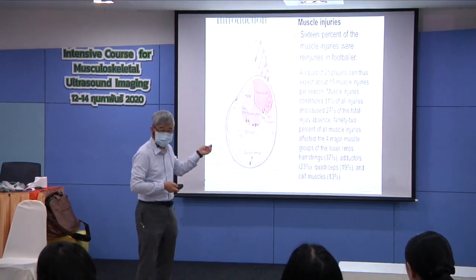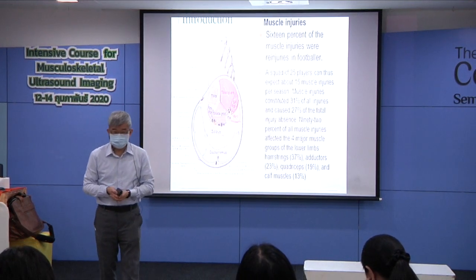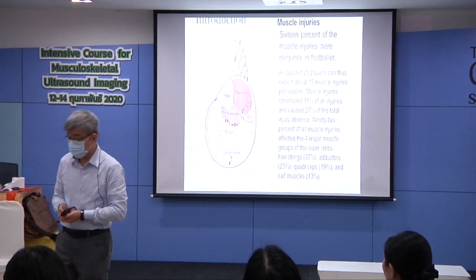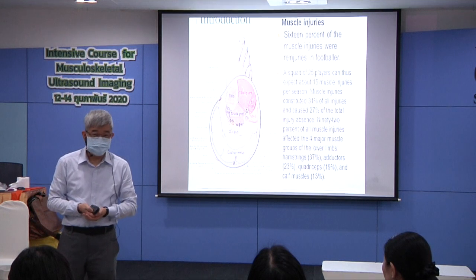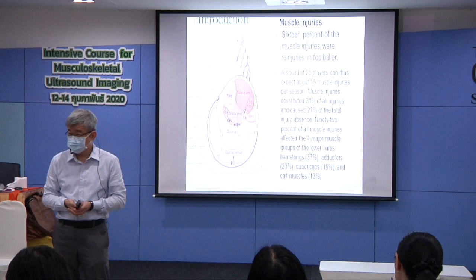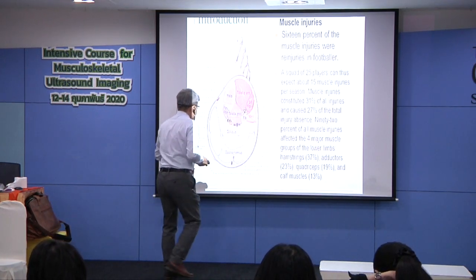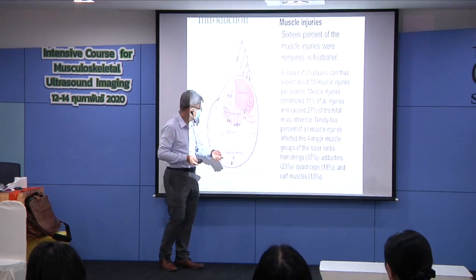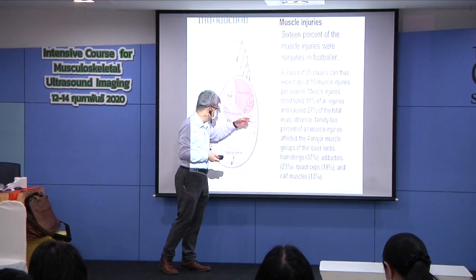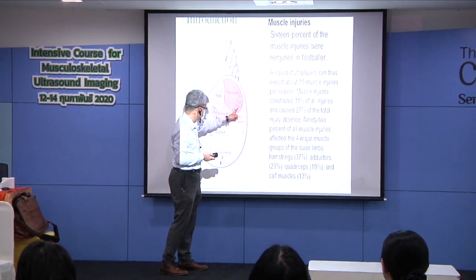So this is the most important figure you need to remember. Okay, it's 12 structures, like our clock. Do you have any difficulty remembering 1 o'clock, 2 o'clock, 3 o'clock? No, right? Because you look at the clock very often. So let me tell you, 12 o'clock, tibialis anterior. 1 o'clock, extensor digitorum. 3 o'clock, 2 o'clock. Sorry, there is another one.